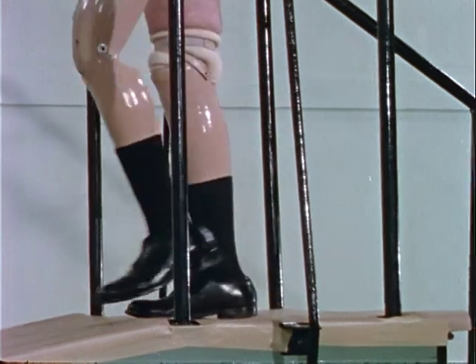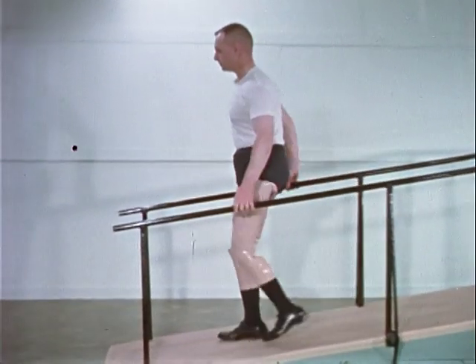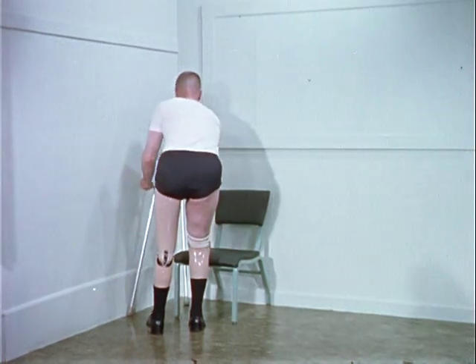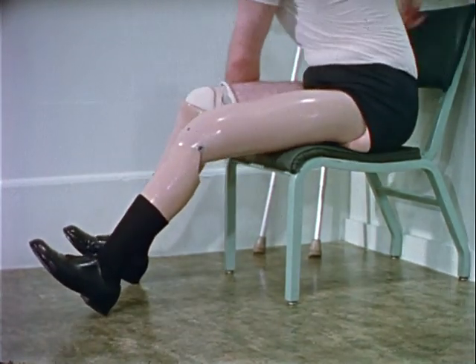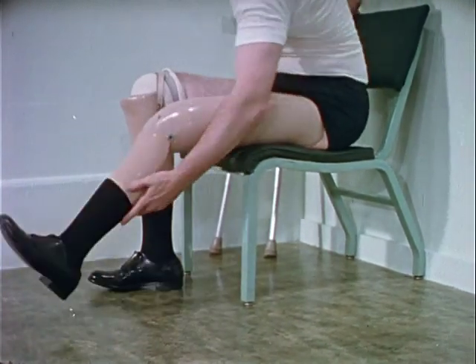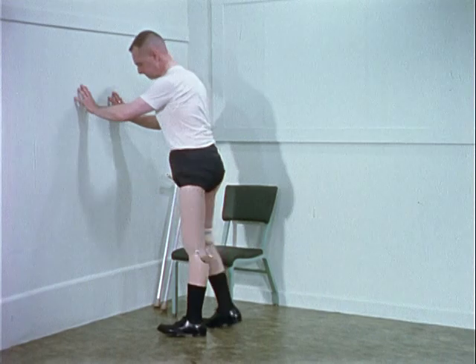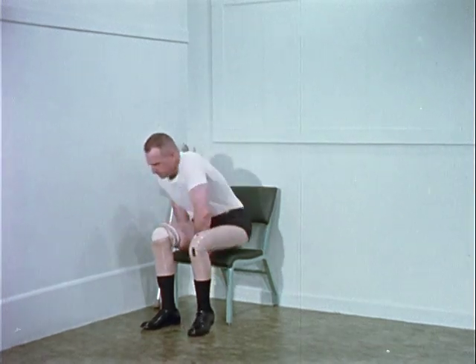In descending ramps, the shortened step prevents buckling of the knee as weight is borne on the above-the-knee prosthesis. At first, the bilateral amputee can be taught to get into and out of a chair by pivoting, as might a paraplegic. The knee of the suction socket prosthesis is locked by contracting the hip extensors. The amputee soon sits in the more conventional manner with less hand assistance and less attention to his disability.